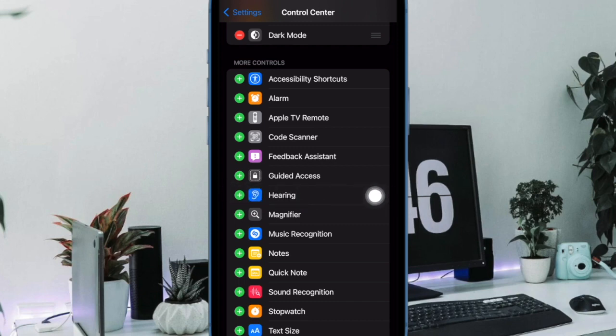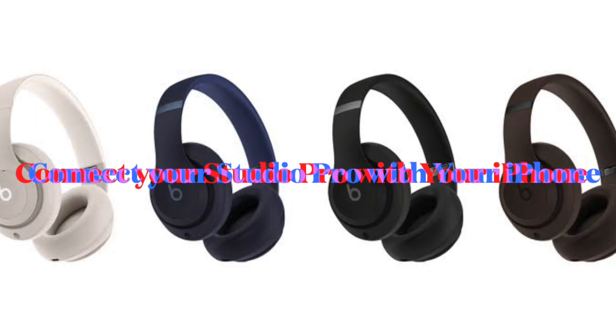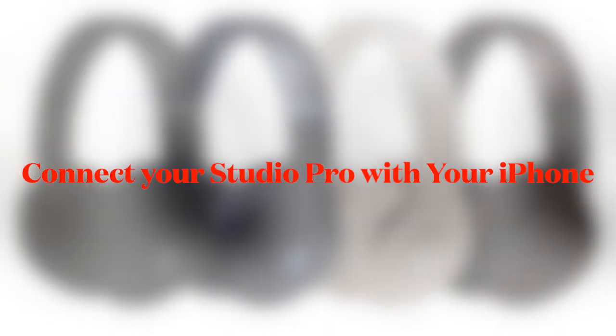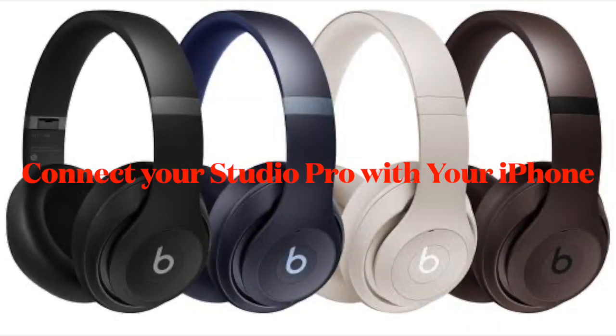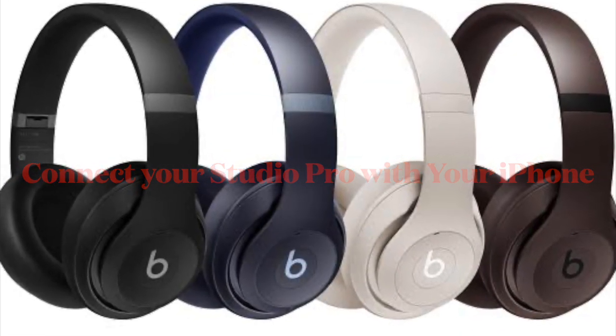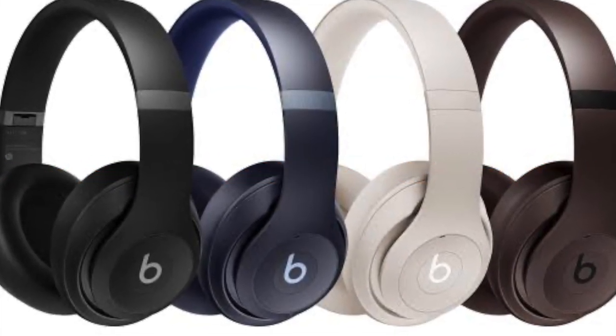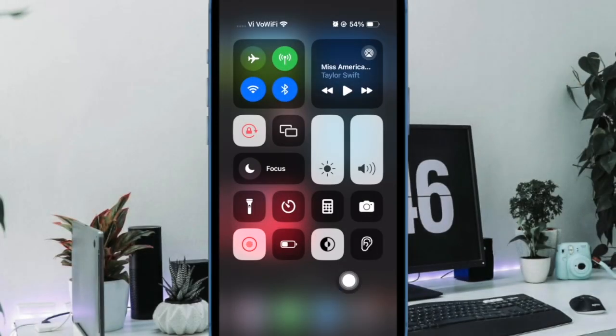Then put your Beats Studio Pro headphones on and connect them to your iPhone or iPad in the usual way. Then open the Control Center on your device.